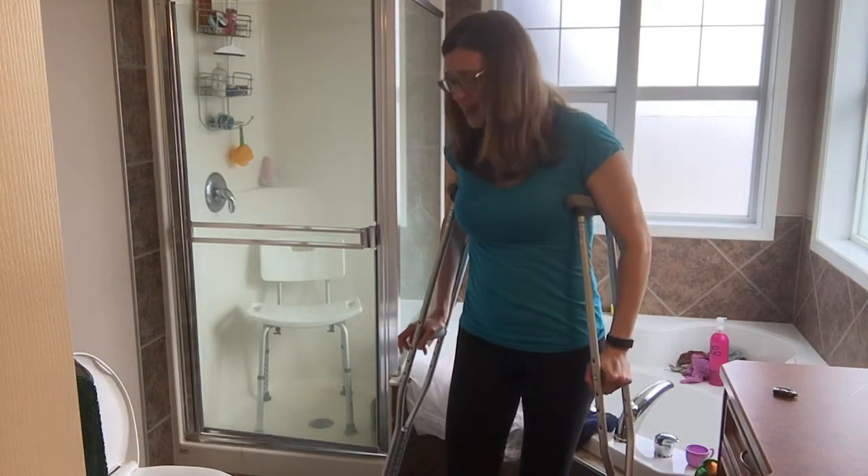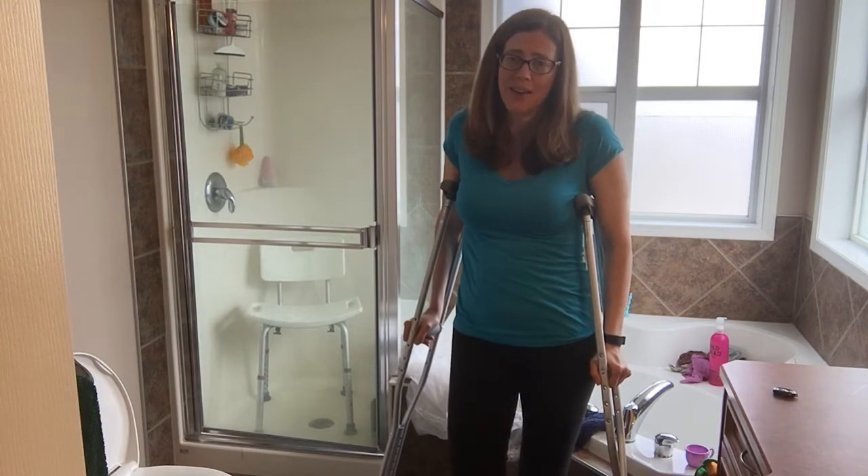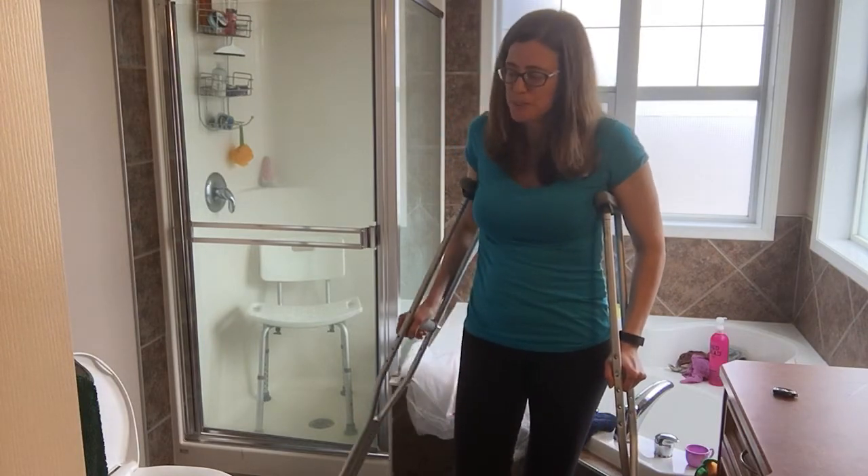One thing you do need to be careful of is the bath mat — make sure you're not going to catch your crutch on it. Be really aware of that.